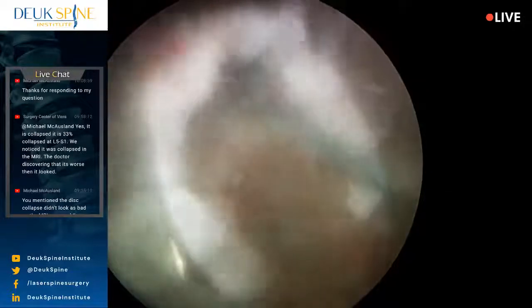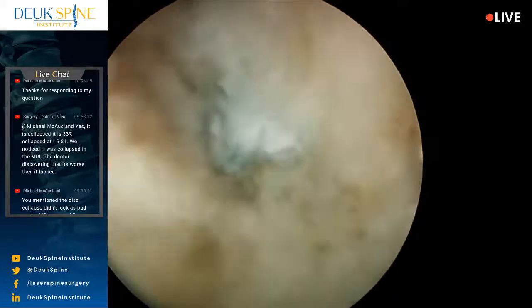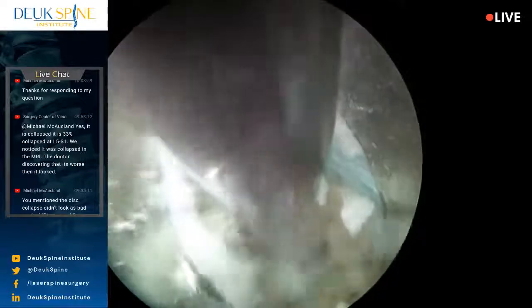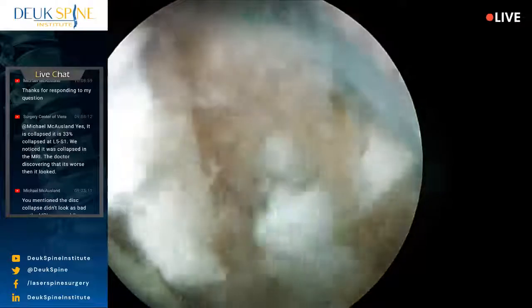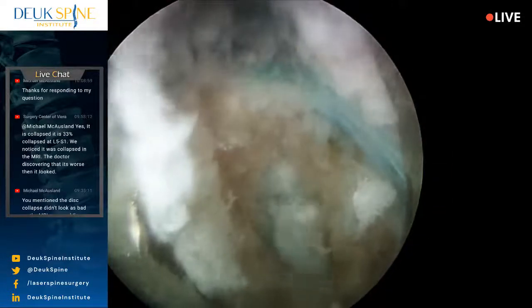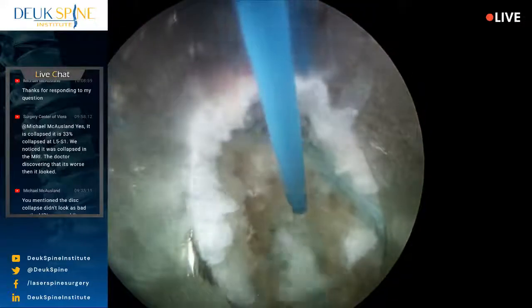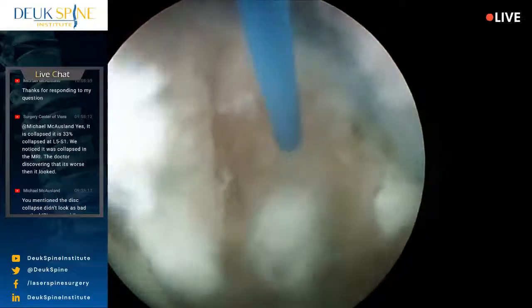We're doing physiological surgery. We're removing the antagonist, which is the inflammatory tissue within the annular tear. That's what the surgery does. So when you go to look afterwards, you're not going to see perfect discs. And people that expect to are misunderstanding what we're doing here. That's why we do broadcasts, to teach people the truth. All right? So after I'm done, the pain will be gone, but the disc will never look normal.